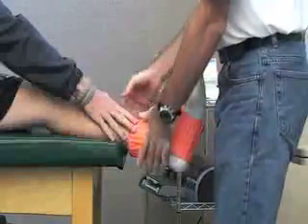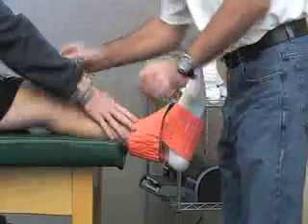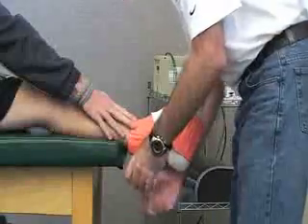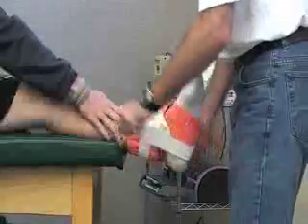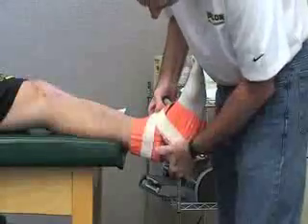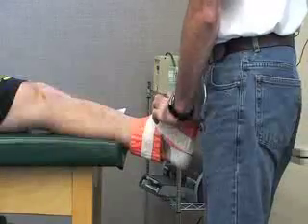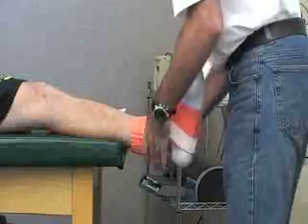Once that's on there, I can also follow up with some tape or triangular bandage — I'm going to use some white tape in this case. You can trace the whole thing if you needed to, or just attach it where you needed to so it doesn't fall off. You want to check the effectiveness of that and make any adjustments you need to make it more snug.